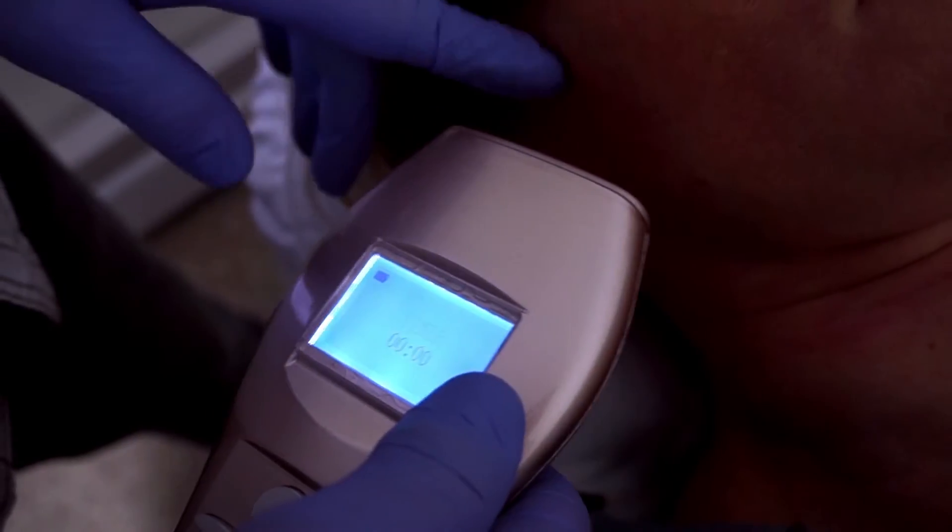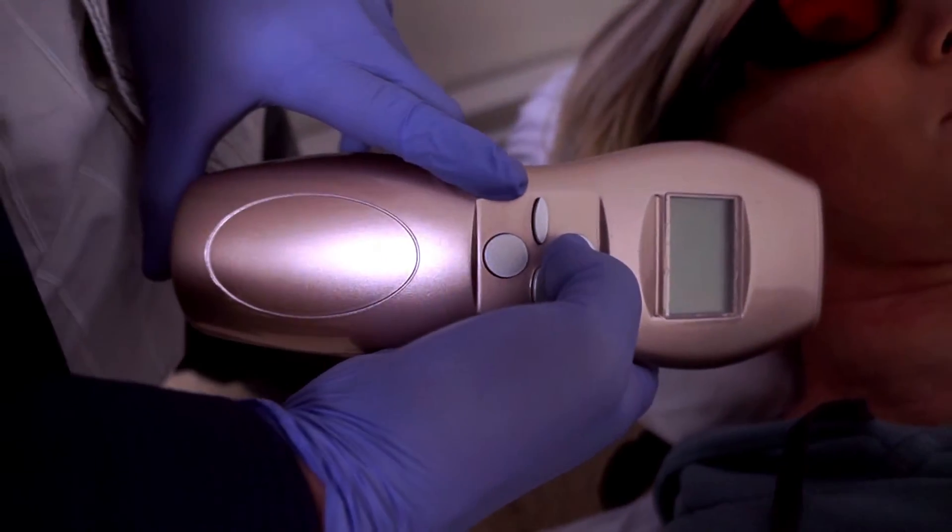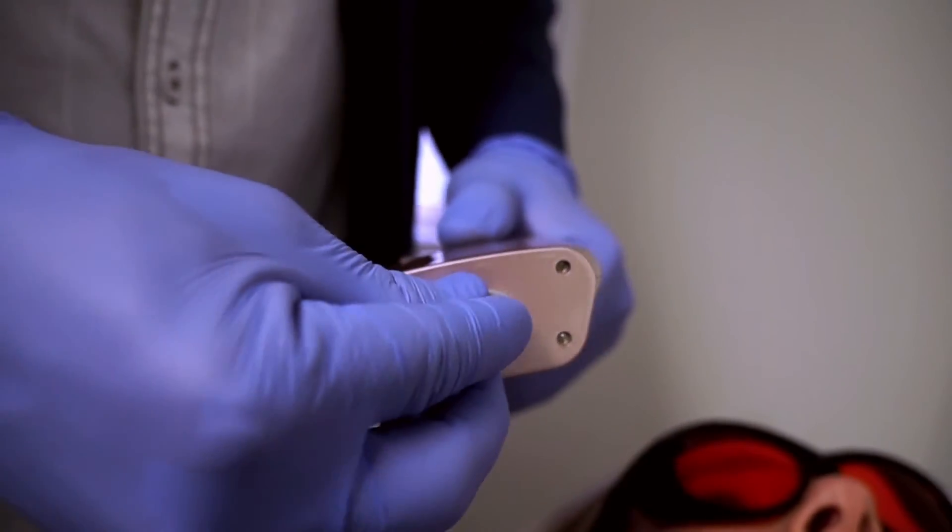The laser will shut off when the timer runs out. Press the tail switch to power off the laser, and then put the safety cap back on the laser.